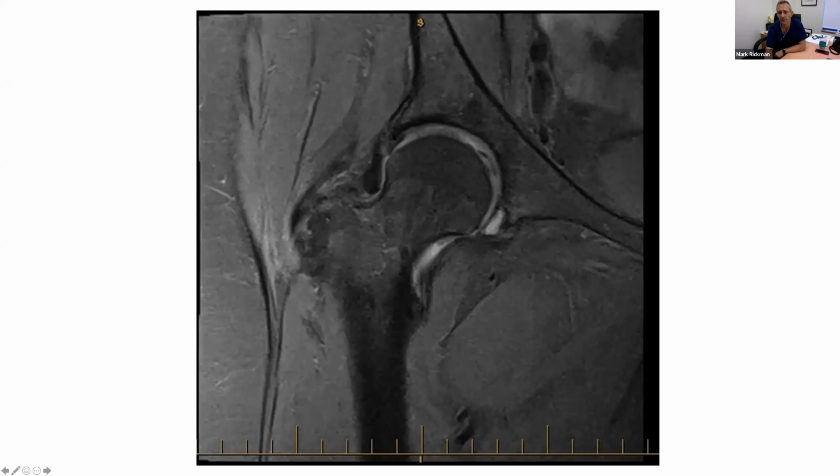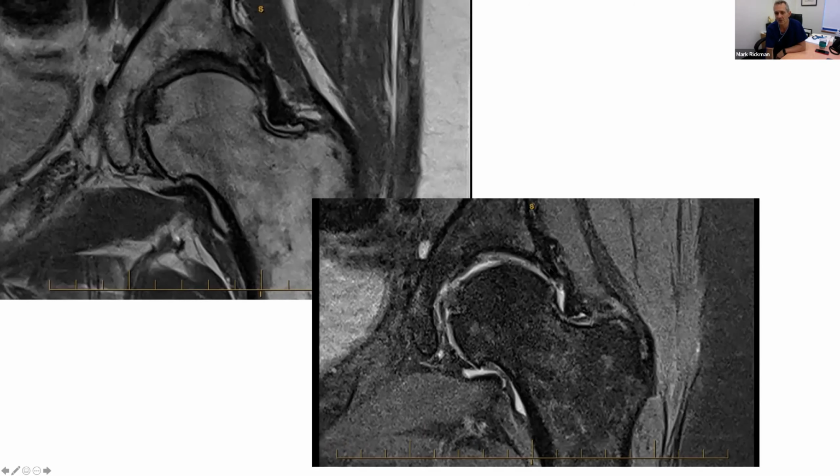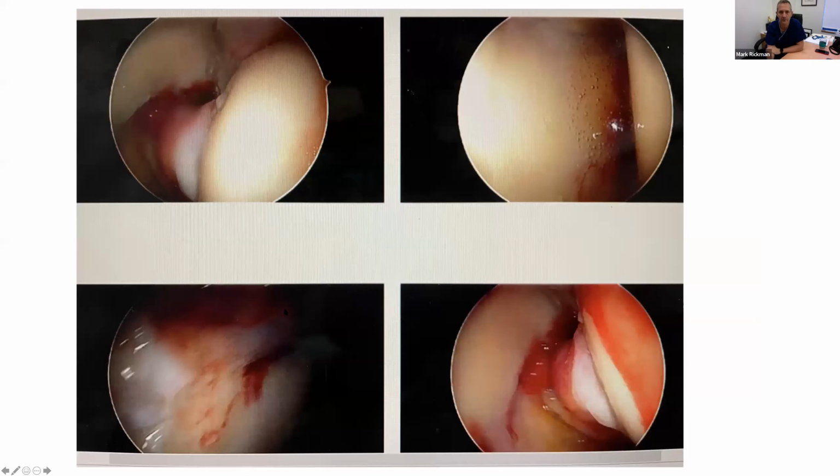In this situation, you can imagine that you can take away some of this bone and you can repair that labrum back up, and that's probably going to do okay. Whereas in this situation, if you take that bone away, which you have to, there's a tiny shred of labrum down here, but there's really not much left. And so the outlook for this hip, I think, is worse than the subspine impingement. Now, even better than that, if you're lucky, you get a patient with just a little bit of anterior wall that overhangs at the front. So the young chap that we saw at the beginning, he's probably just got a little bit of excess anterior wall. And that group is fine, because you can just take the labrum off, debride it, put it back on, they do much better. But they all get called pincer impingement, and they're all different.